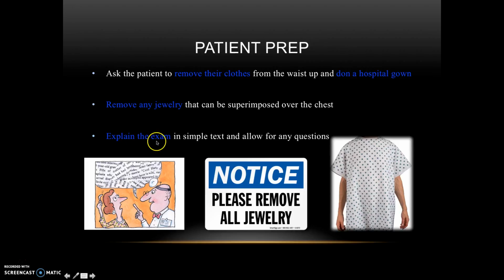And then we're going to explain the exam in simple terms to the patient and allow for any questions. By this I mean a lot of times we want to get fancy and speak in medical terminology to the patient, and it's difficult sometimes for them to understand. So if you explain the exam in simple terms, they will understand, they will know what's expected of them, and you will have a good study. You want to have an open conversation and allow for any questions they might have.